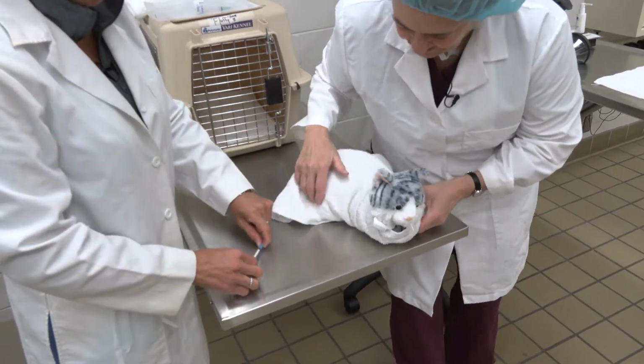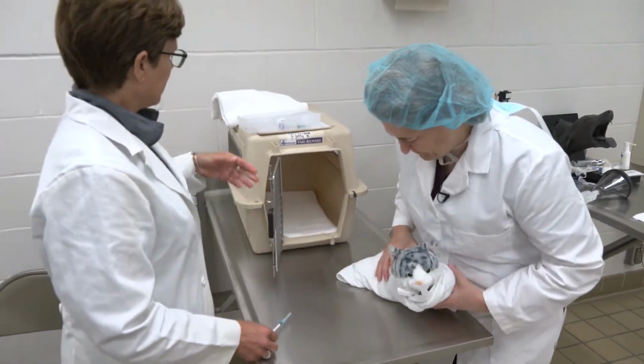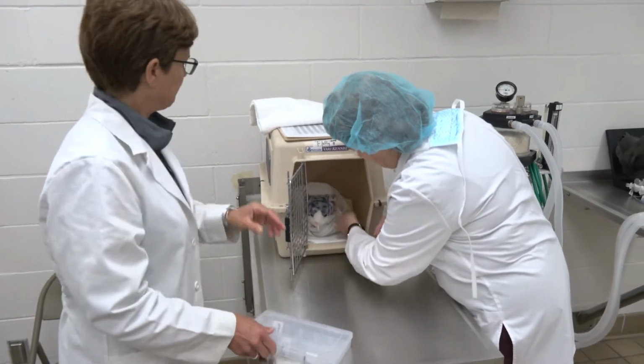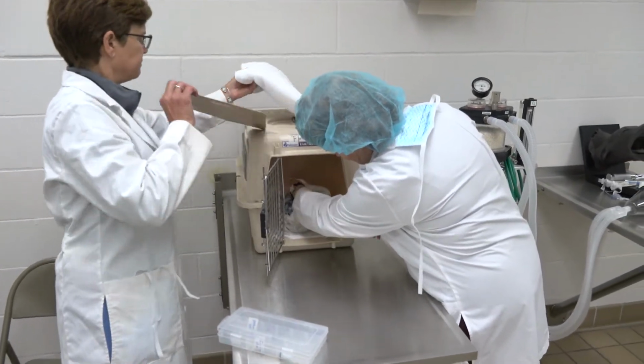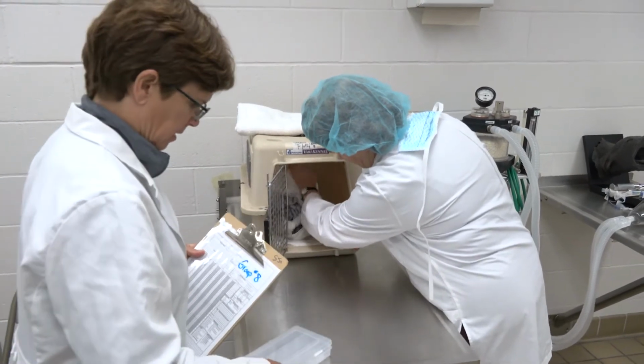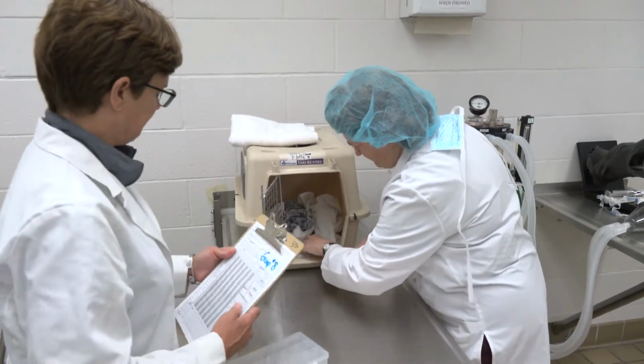And we're going to let the kitty cook in its carrier. And one of the anesthetists will stay with it. I'm going to also note the time that we gave that. Okay. And we're going to go set up our catheter supplies while the animal's cooking.